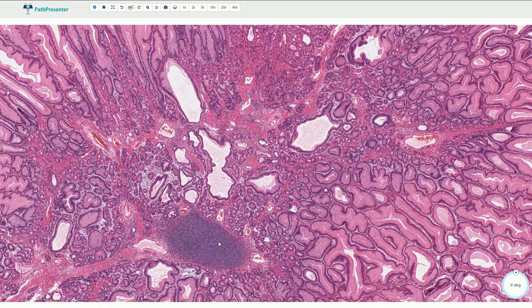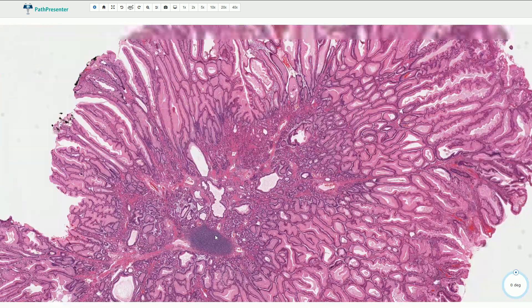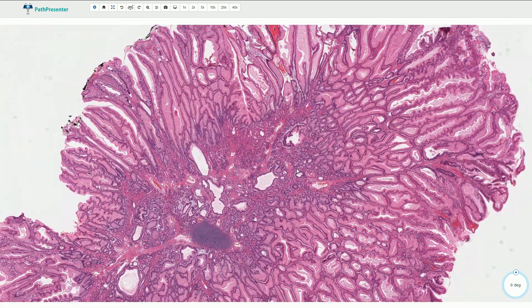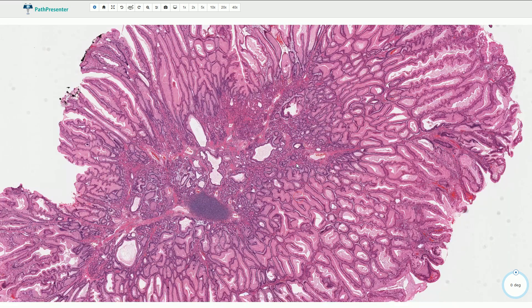Here we have lymphatic tissue. Peutz-Jeghers polyps can be sporadic or they can be associated with Peutz-Jeghers syndrome.